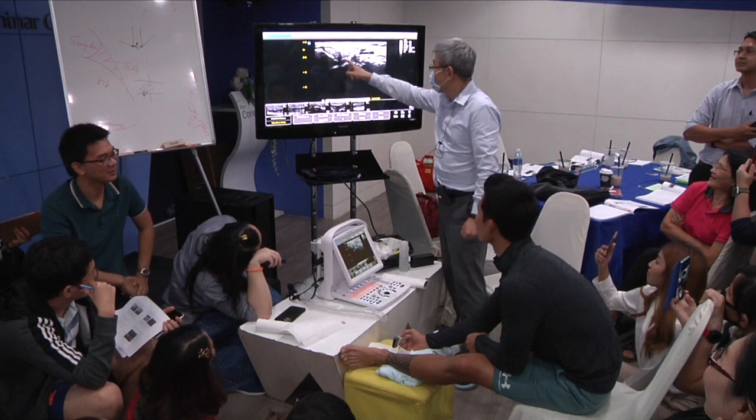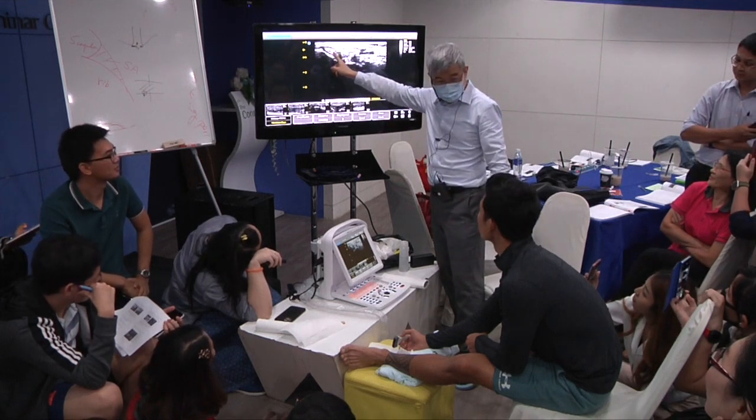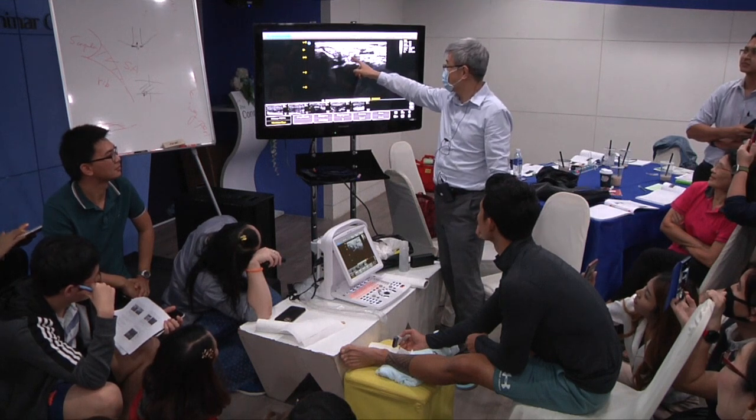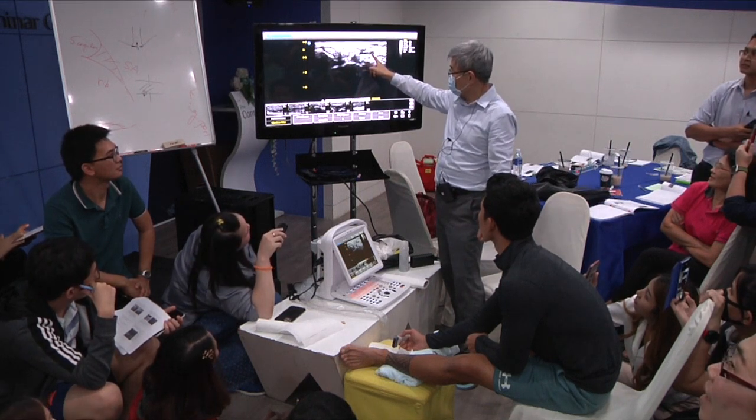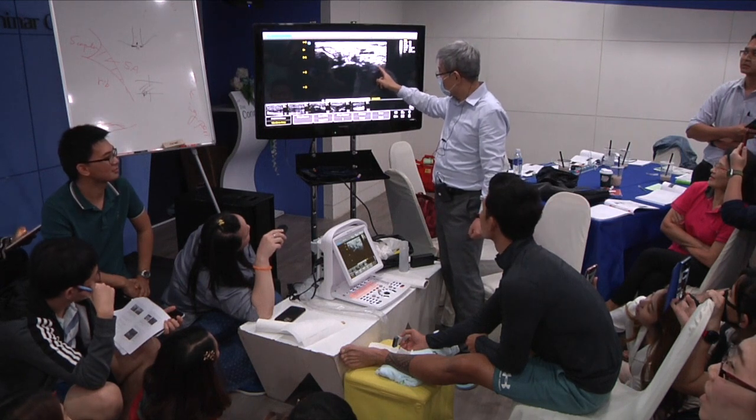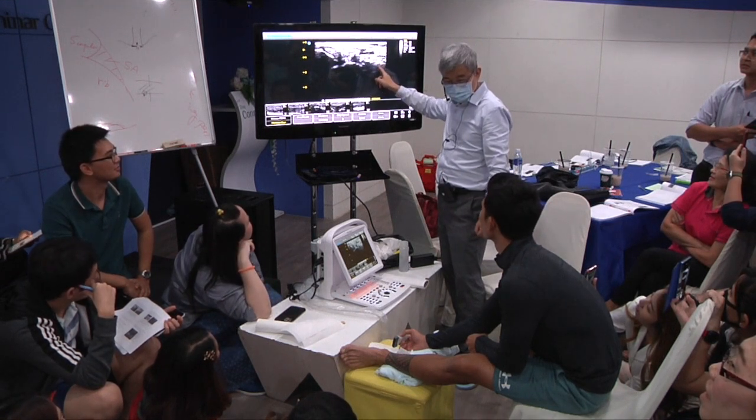Okay. Find the tibia posterior, right? Find the flexor digitorum tendons. Move to the artery. Then this is nerve. Flexor hallucis tendon is waiting for you here.